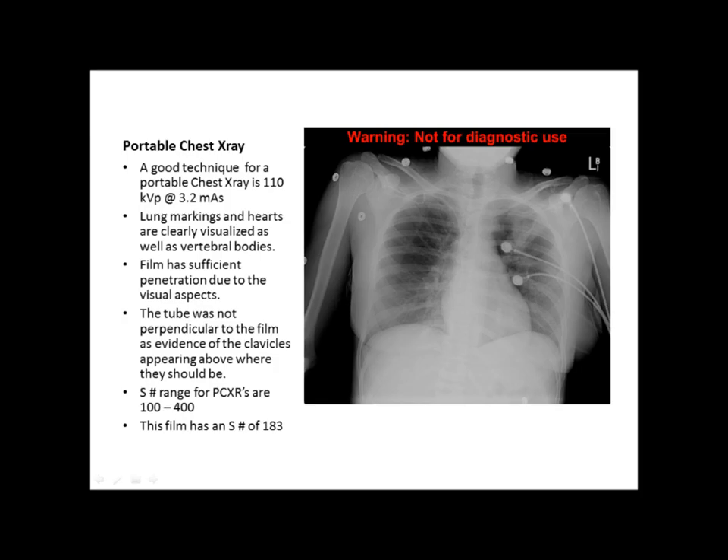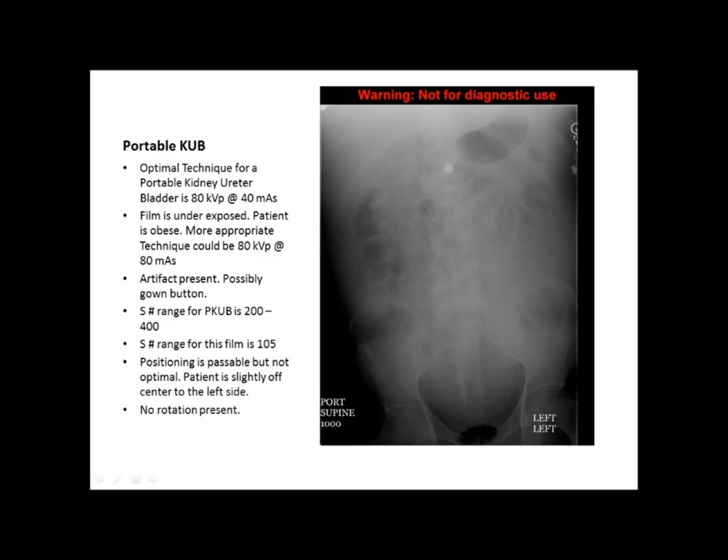The next film is a portable KUB — kidney, ureter, urinary bladder. The optimal technique for a portable KUB is around 80 kVp at 40 mAs. The film appears to be underexposed. The patient is obviously obese, which probably has a lot to do with it. We think a more appropriate technique could be 80 kVp at 80 mAs. There's an artifact present in the middle of the film that looks like possibly a gown button.